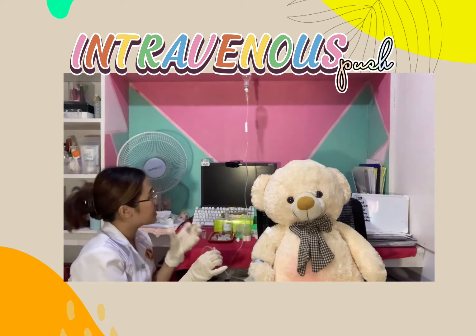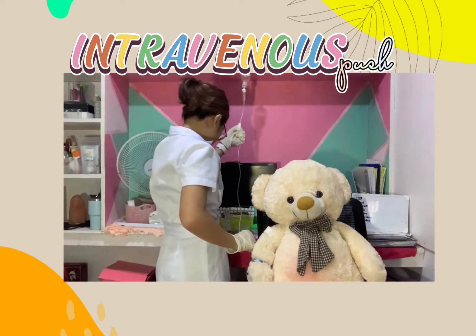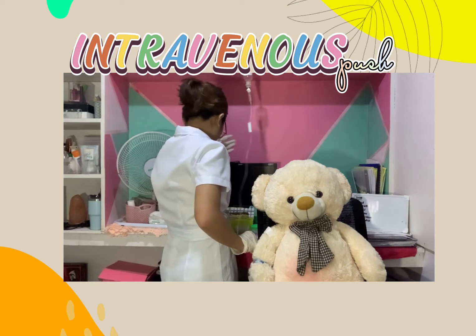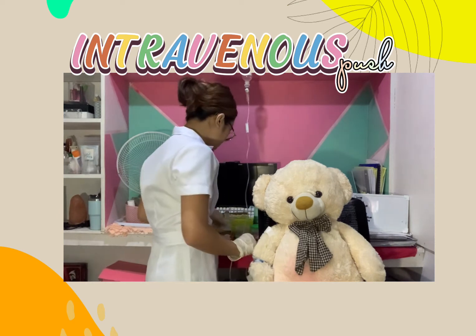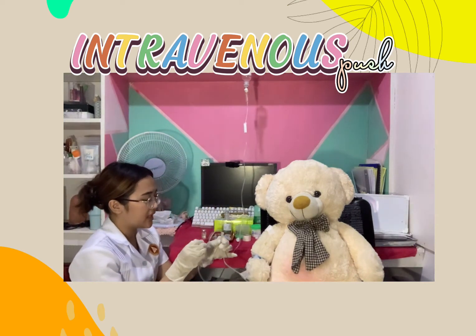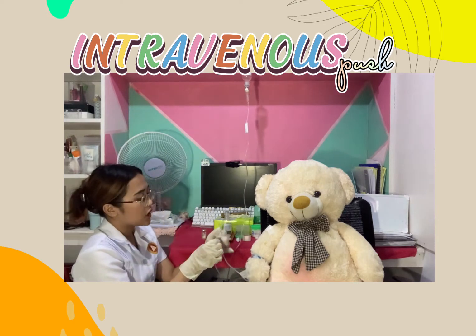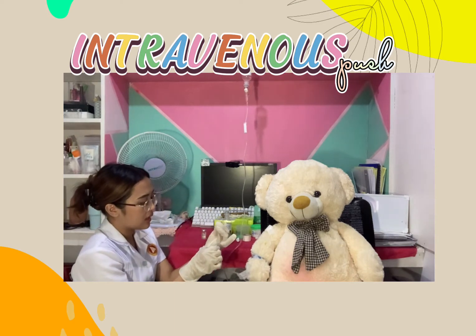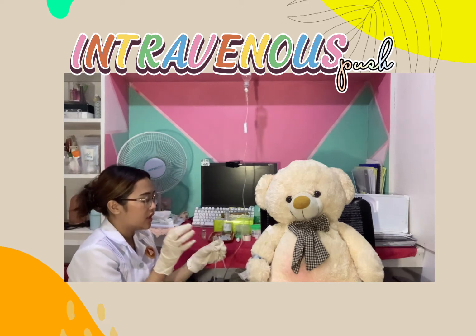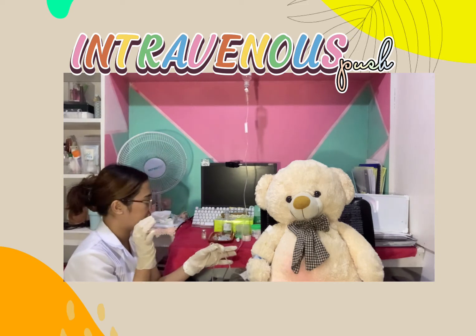So, before administering it, we first need to close the clamp. So, after closing the clamp, we can now start administering the medication to the injection port. Or, you can also pinch the tubing or close the clamp before administering the medication. So now, we will now administer the ordered medication to the patient.